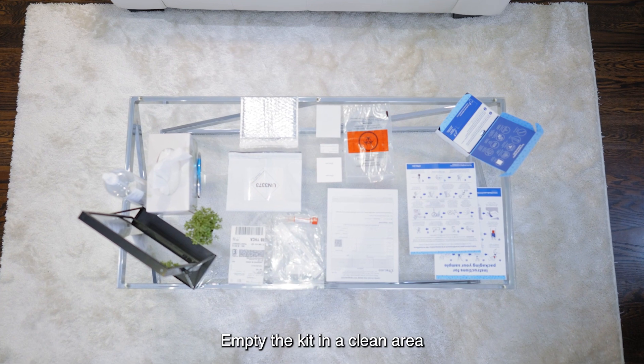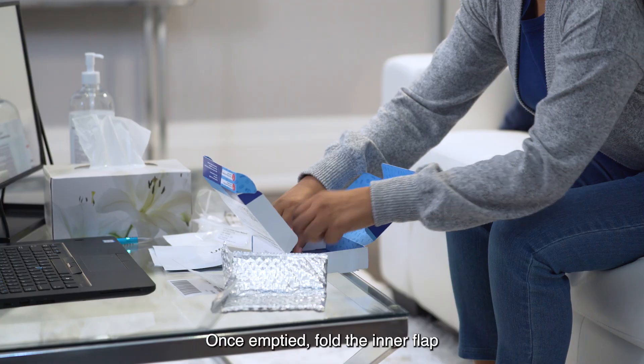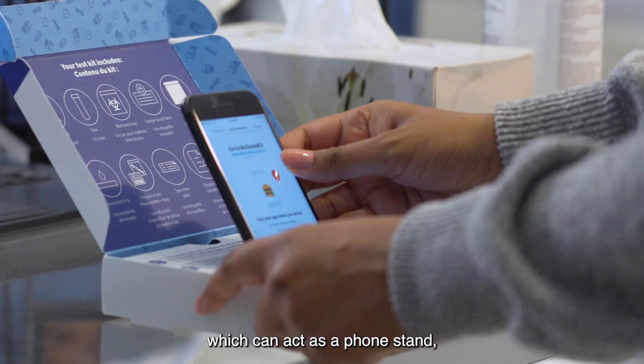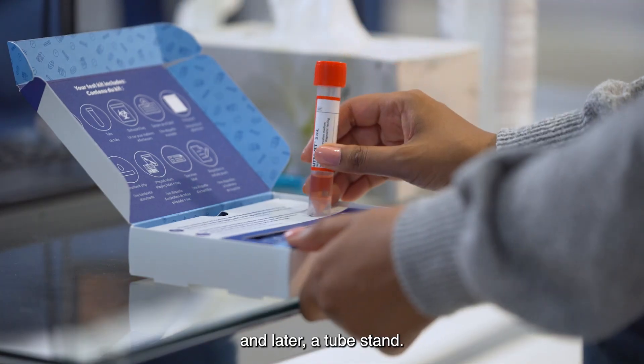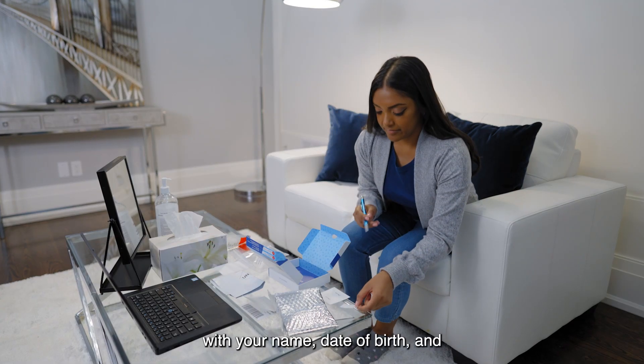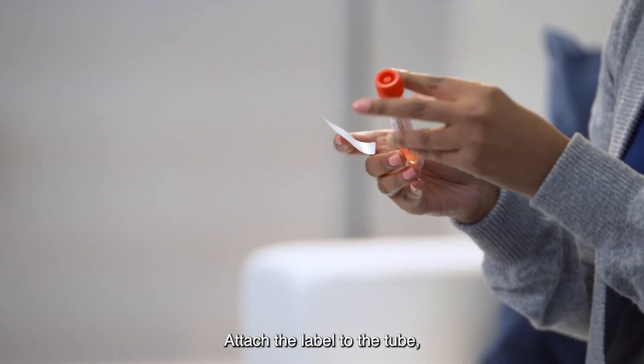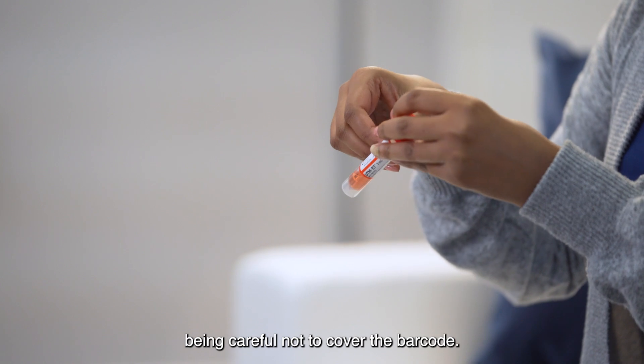Empty the kit in a clean area and on a flat surface. Once emptied, fold the inner flap back into the box, which can act as a phone stand and later a tube stand. Fill in the specimen label with your name, date of birth, and date and time of collection.